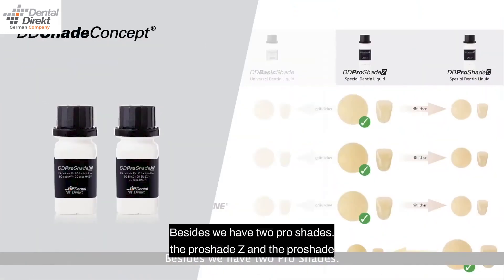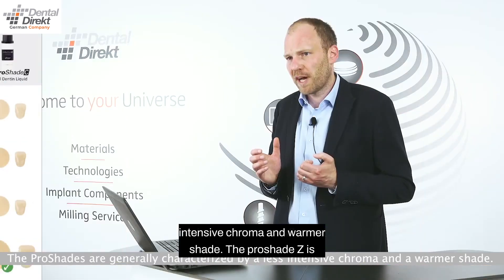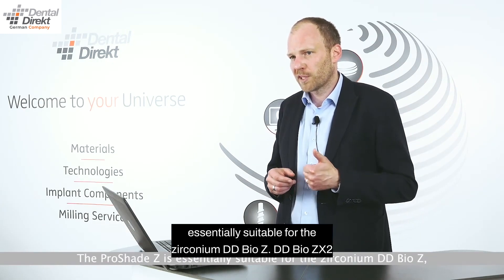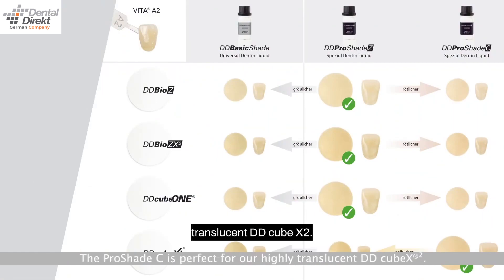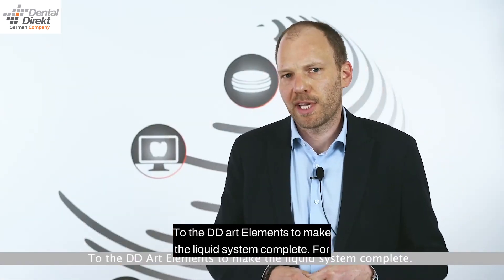Besides, we have two Pro Shades: the Pro Shade Z and the Pro Shade C. Pro Shades are generally characterized by a less intensive chroma and a warmer shade. The Pro Shade Z is essentially suitable for the DD Bio Z, DD Bio Z X2, and DD Cube 1. The Pro Shade C is perfect for our highly translucent DD Cube X2.